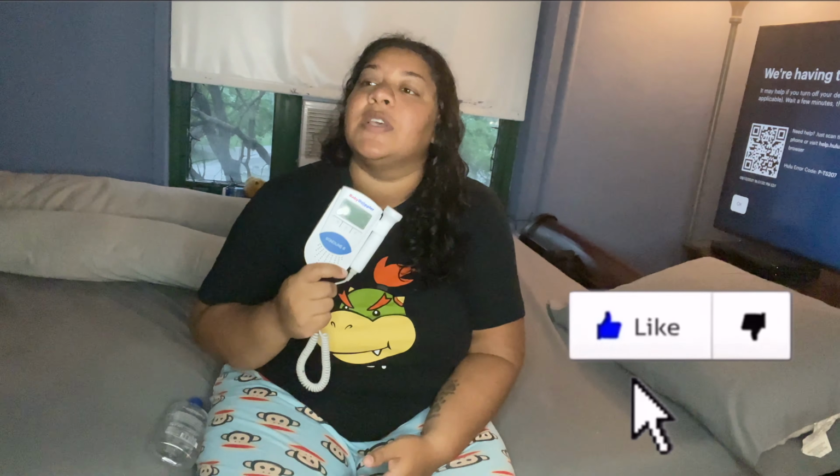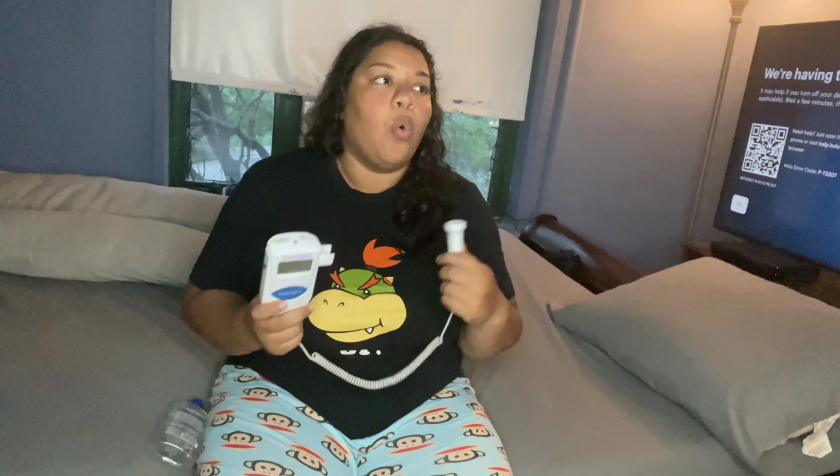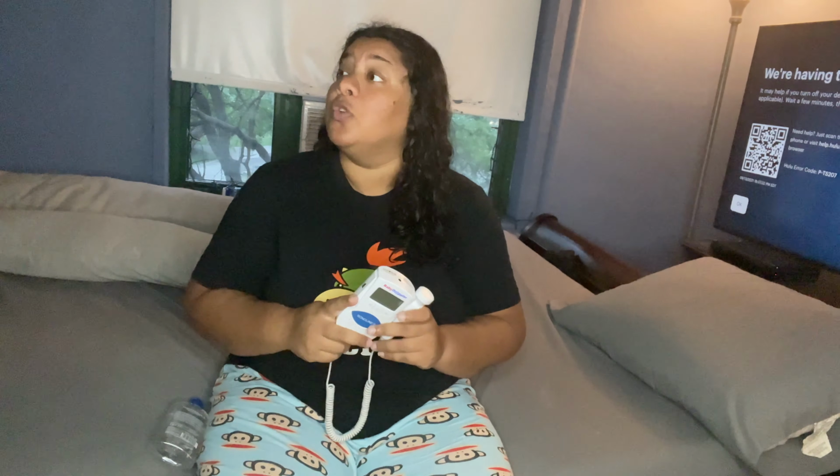Does it take the place of your appointments? No. Does it take the place of your scans? No. Because again, it's just this little probe rubbing around, hearing all your bodily functions. Do not do this right after you eat. Do not do this right after you get out of the shower. Do not use this after you exercise. You want to do this when you are laying the way I was laying, in a calm state, staying still, legs straight out. If you are early in your pregnancy, you may not be able to hear the baby.